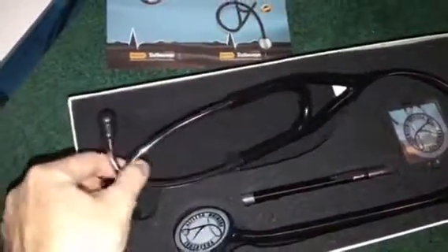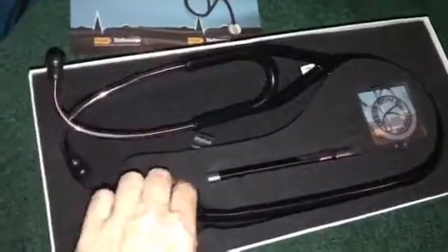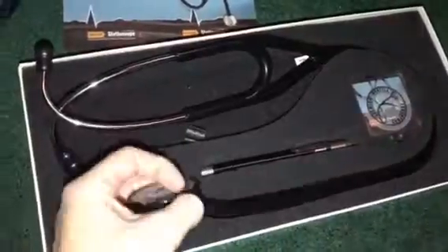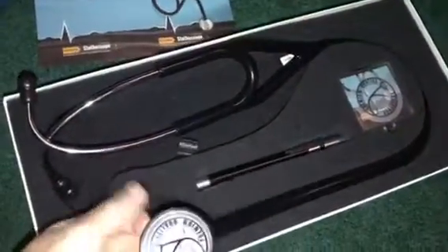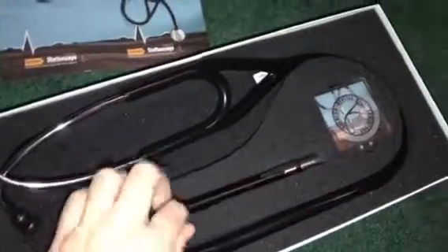Then you have the stethoscope itself with the earbuds, and then the actual chest piece that you put on the heart to check it.